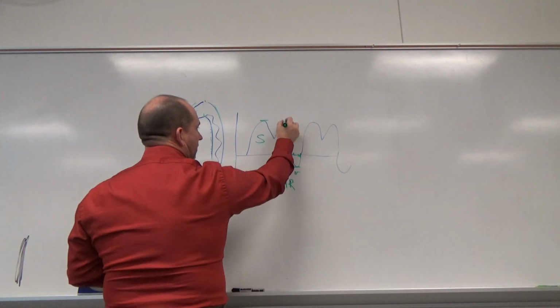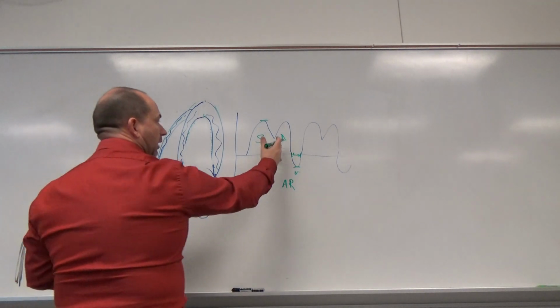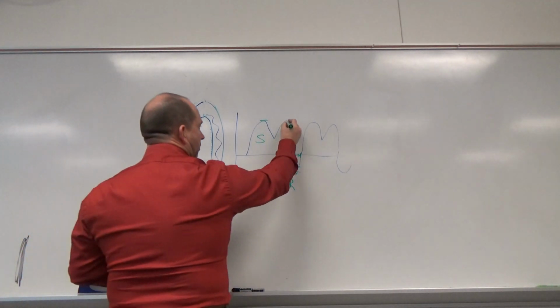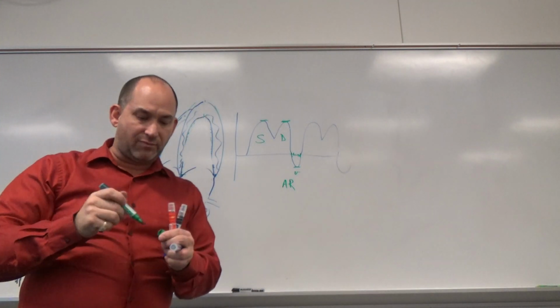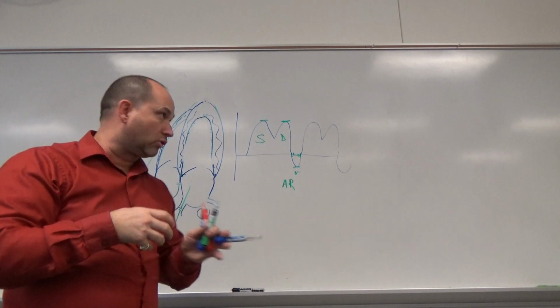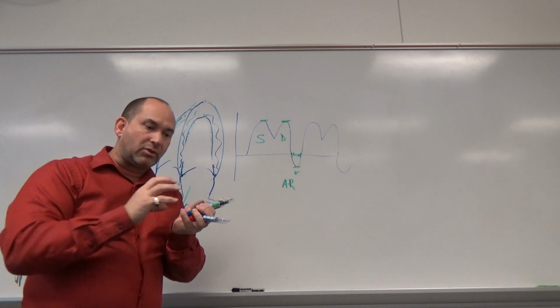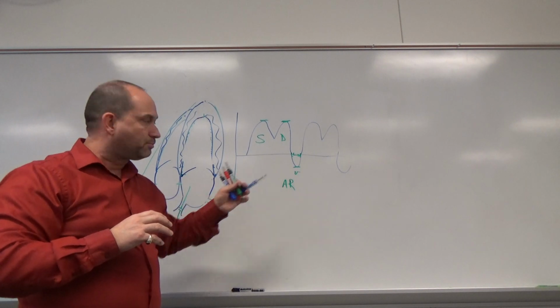So S wave is the systolic forward motion through the pulmonary veins, and the D wave is the diastolic motion through the pulmonary veins. And you wonder, why are we getting forward flow in both of those? Well, the pulmonary vein doesn't have any valves in it. When the ventricle is contracting, so this is during systole, that causes the mitral valve to shut. The atrium is filling, so I get forward flow out of the lungs into the atria.